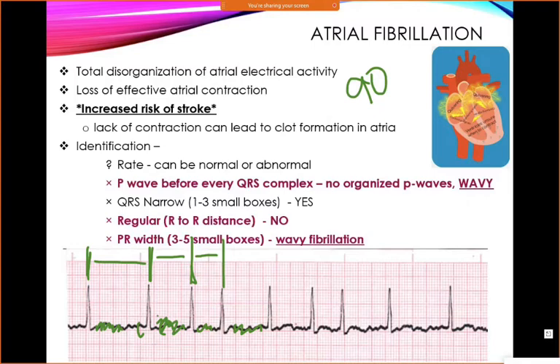It's basically the atrium is trashed. The atrium is fibrillating, and it is not contracting appropriately. It's not conducting appropriately. It's called atrial fibrillation because that atria is just quivering up there, and the electricity is not making it around in a nice hump. So if you wanted to call this a block, you would need a solid P wave that you can measure. There's no solid P waves here. If it's just junk, it's just junk, okay? You can call it AFib if it's irregular. Does that make sense?